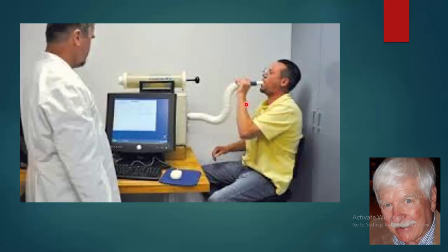Here you see an individual hooked up to a spirometer. He will breathe in and out of that spirometer. This big plunger here is for calibrating the spirometer. The device that's measuring it is this light-colored thing back here. That's the actual spirometer, and then it's hooked up to a computer to record it.